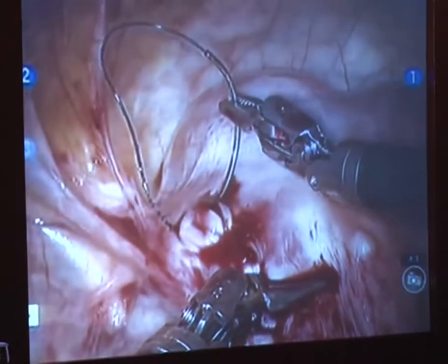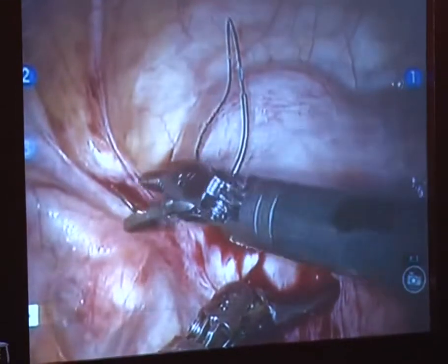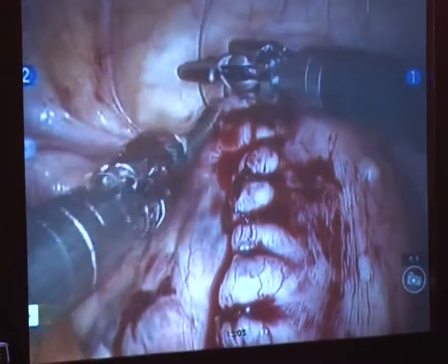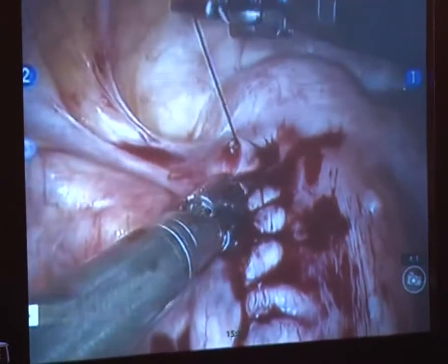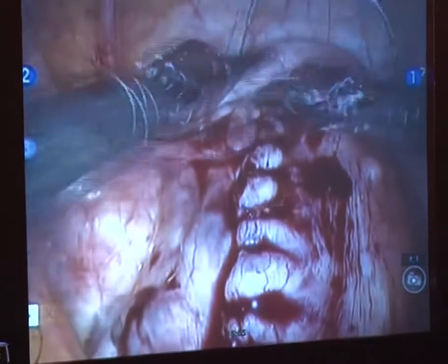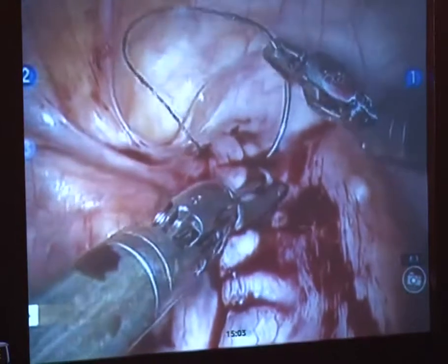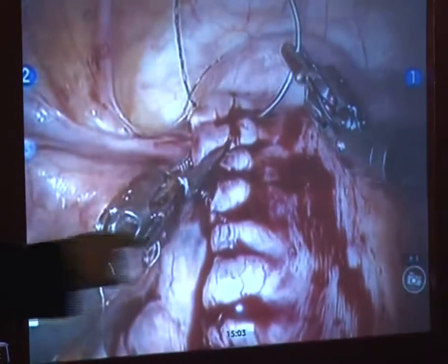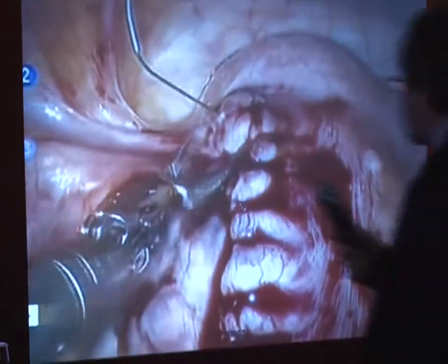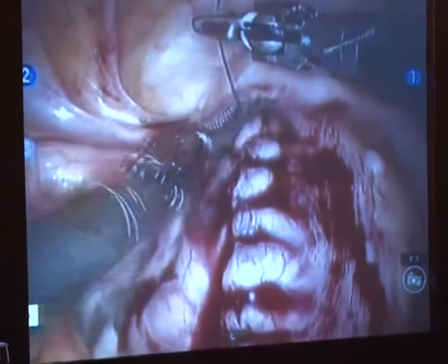Can somebody come in with a scissor and just cut this flush right here? Okay, so we have that done. Arnie, do you avoid the suture cut when you are running suture? I typically try not to use the suture cut. If I'm not doing a live case and talking and distracted, I'll use the suture cut. But in cases where I've got a lot going on at the same time and I could get distracted and cut my suture off by accident, I'll use the mega.